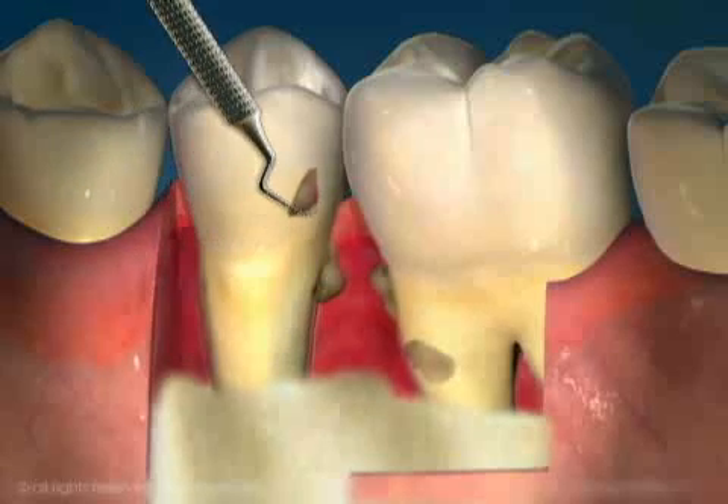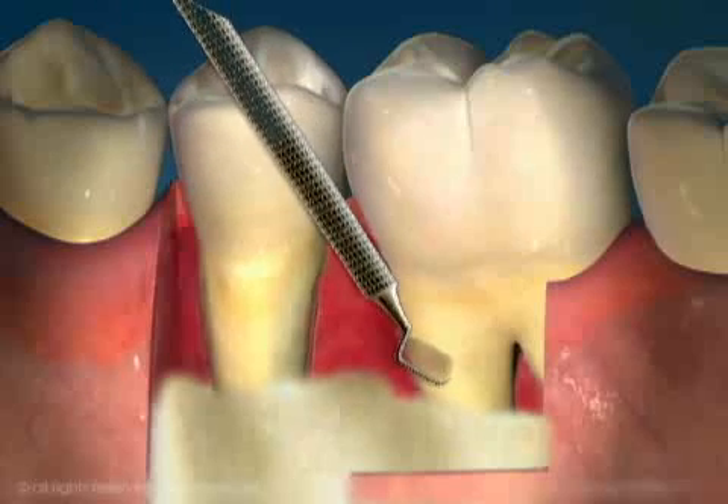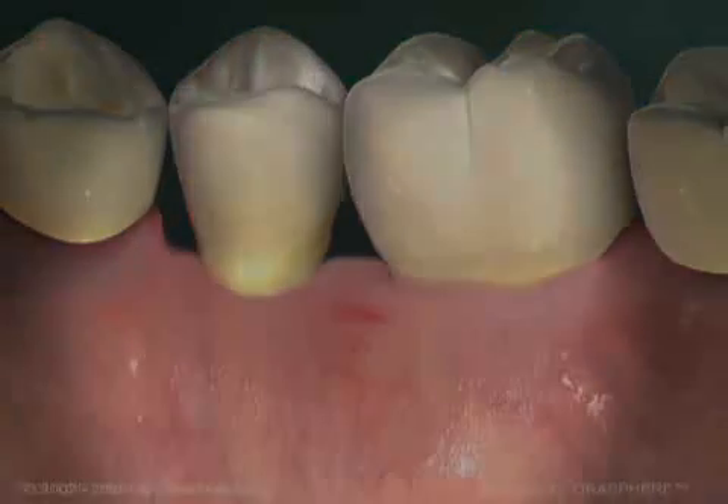The surfaces of the crown and root of the tooth are left as smooth as possible, allowing for maximum ease in cleaning and to inhibit the formation of new plaque and calculus. After the pockets are reduced, personal home care will help prevent them from recurring.